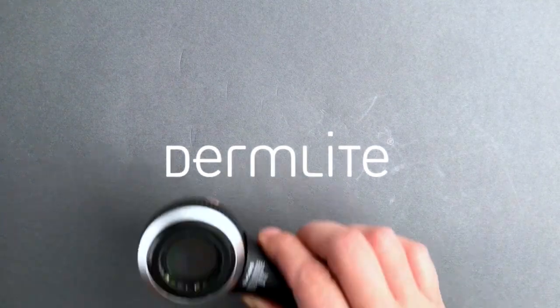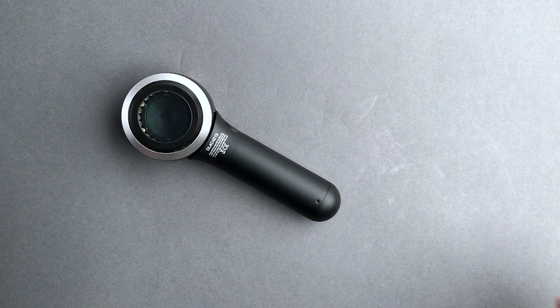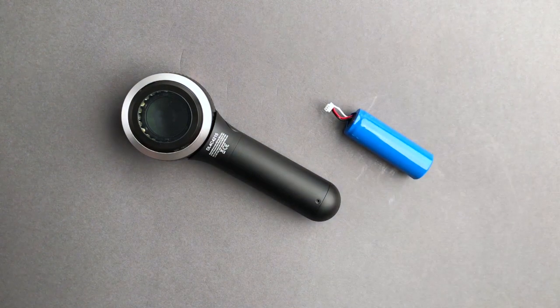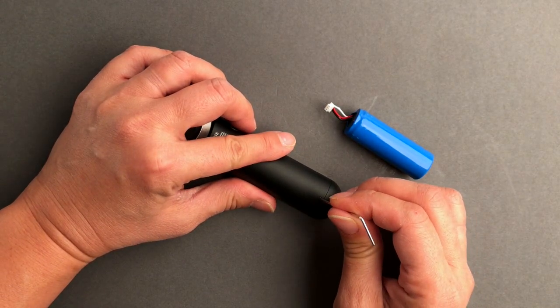This is how you replace the DermLite DL4 battery. Here's what you need: a DL4, a battery, and an Allen key, which is included with the replacement battery.